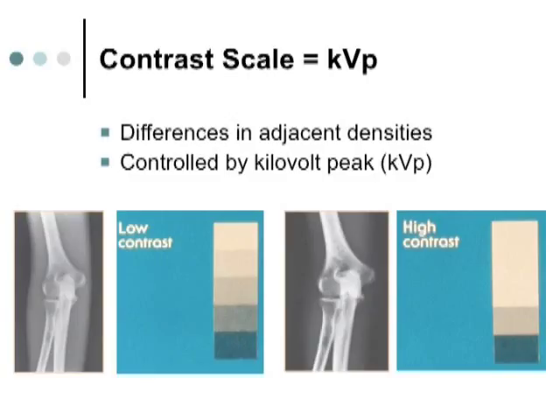So for a chest X-ray, for example, 110 KVP. Most chest X-rays, we like them to be gray. We like a long scale of contrast, a lot of gray on there. You need high KVP to penetrate through the denser areas of the body. With a mammogram, we want them to be black and white, right? You don't want a gray mammogram. You want it to be black and white. You want to be able to see the microcalcifications in there. We have to use very low KVP so that the patient has the opportunity to absorb the radiation.